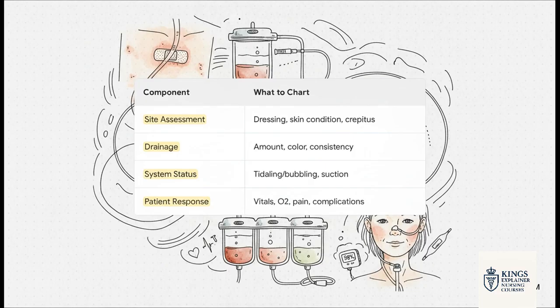And finally, your charting. You know the classic nursing saying, if you didn't document it, it didn't happen. Your note needs to paint a complete picture. So you'll chart your site assessment, what the dressing and skin look like. You'll chart the drainage, the amount, color, and consistency.